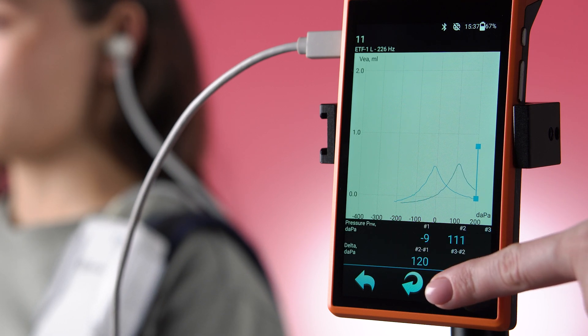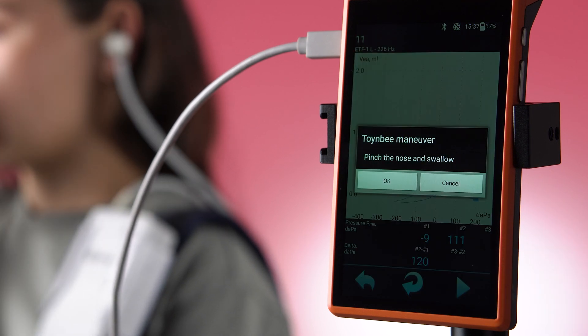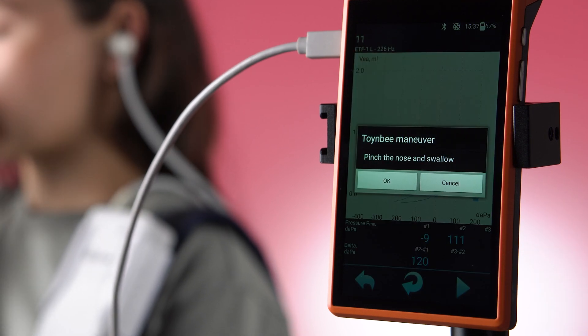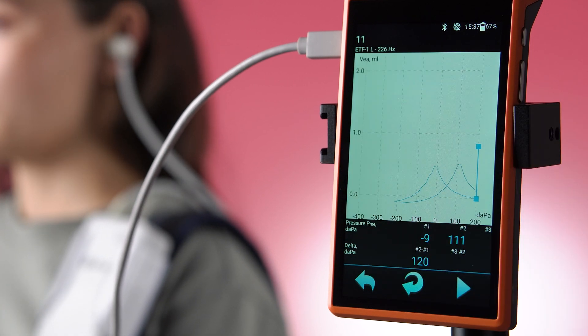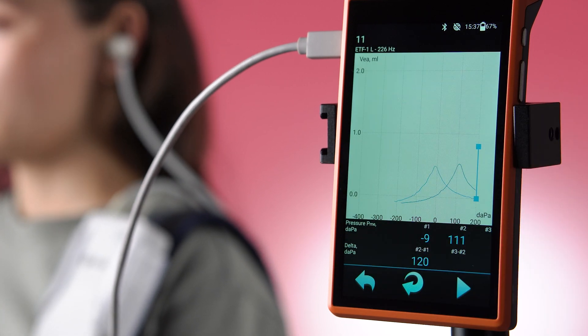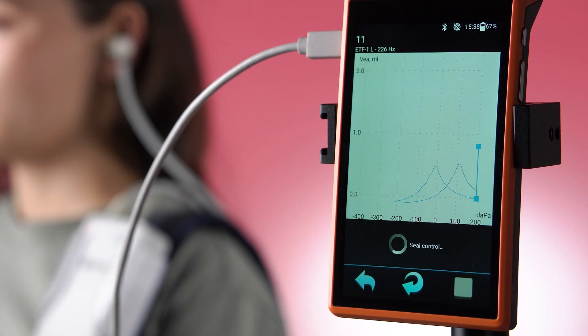Press the arrow to receive instructions for performing the Toynbee maneuver, after which the third tympanometry is performed.